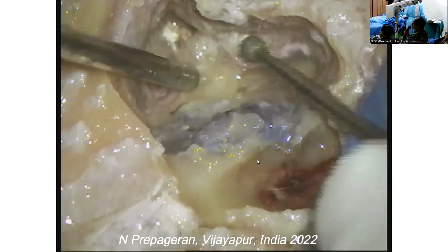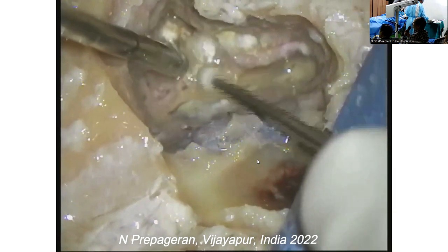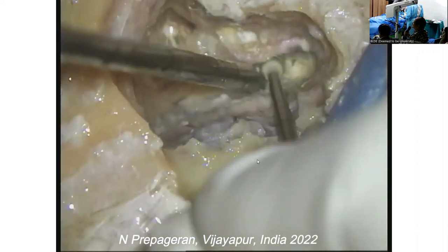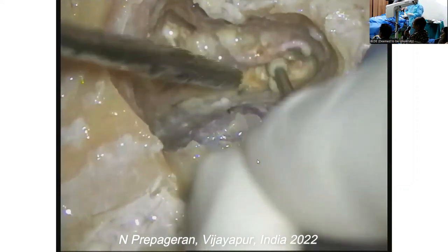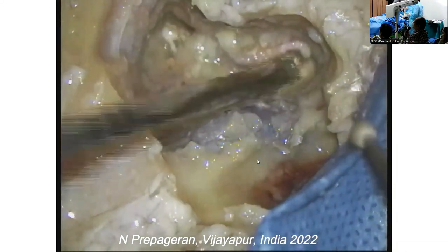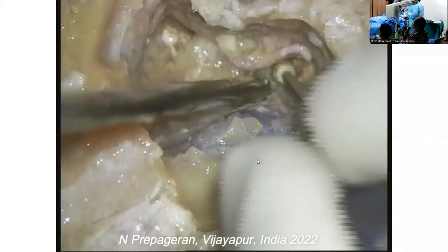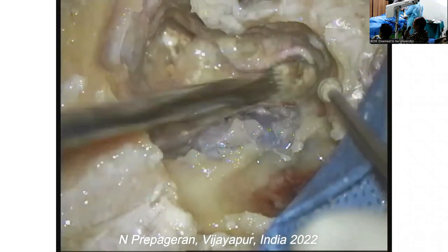Now, for my junior colleagues here, you can see the facial nerve becoming lateral as it comes towards the stylomastoid foramen. At a depth it is in the middle, but it becomes lateral here. So I'm going under the facial nerve. While doing canaloplasty, you should be careful in the lower portion, otherwise you will injure the facial nerve here. There, jugular bulb, guys. Can you see the blue here? That's the jugular bulb under the facial nerve. I don't know whether you can see clearly on the screen or not.